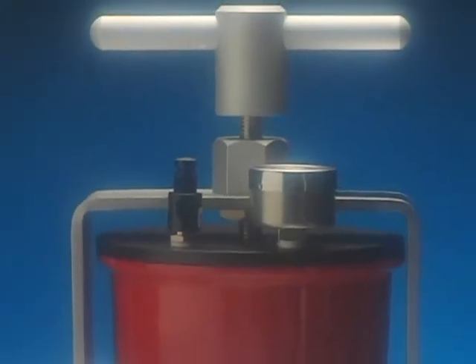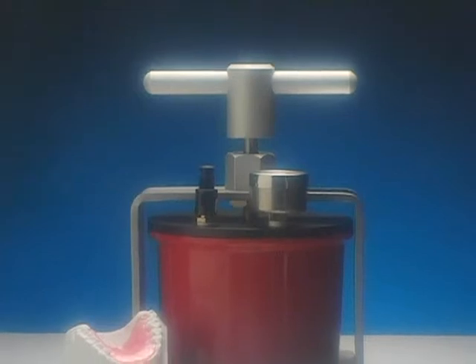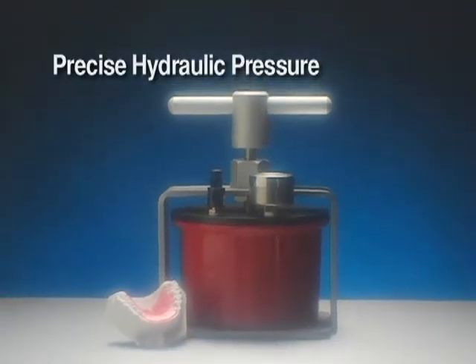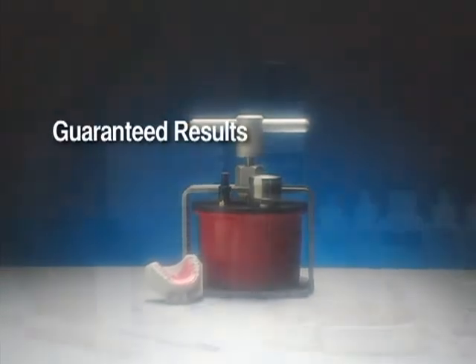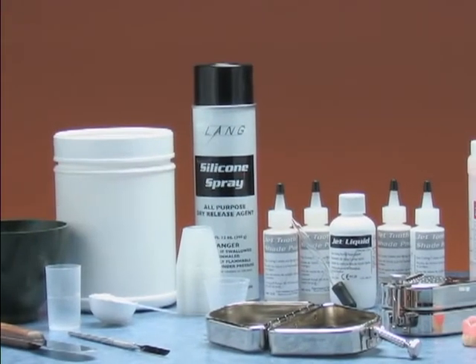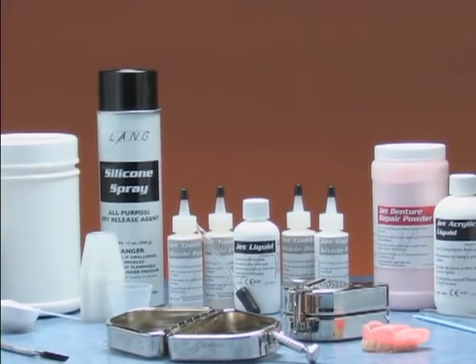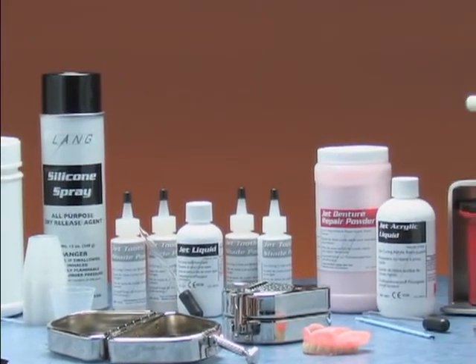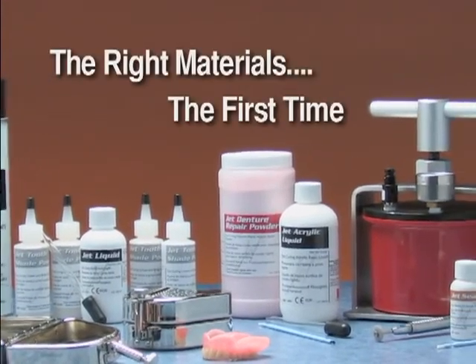This all helps you give your patients the finest dental appliances. The AquaPress provides precise hydraulic pressure, easy operation, and guaranteed results. And for accurate results every time, try Lang's complete line of products, including jet acrylics — the right materials, the first time.